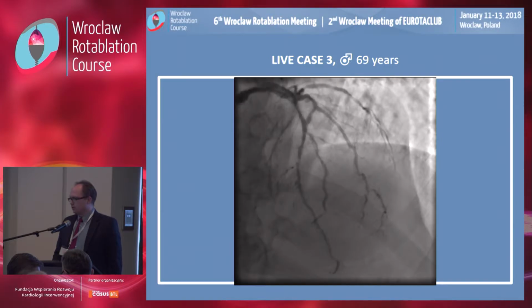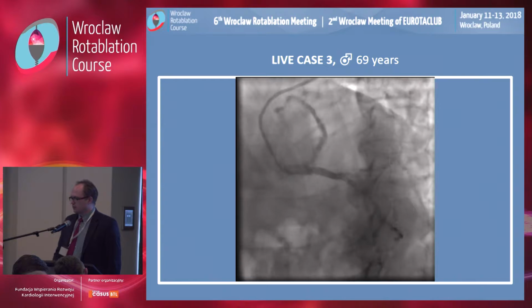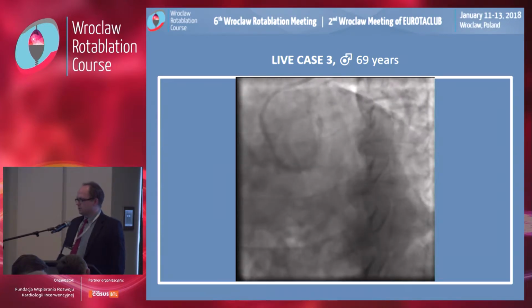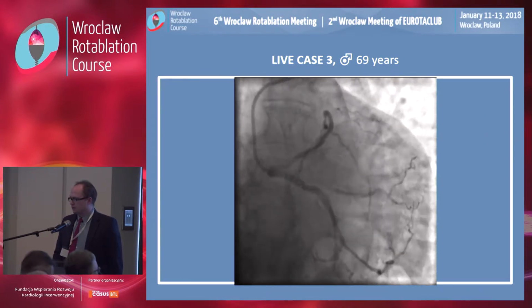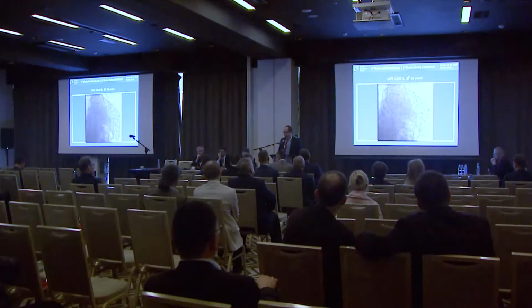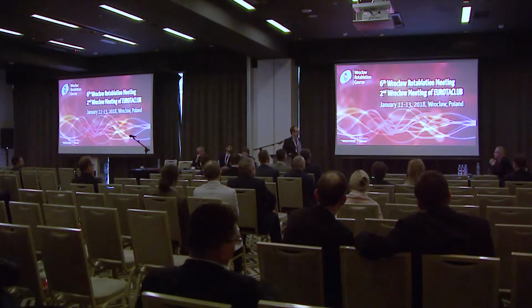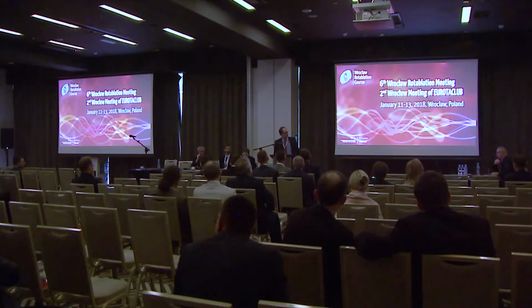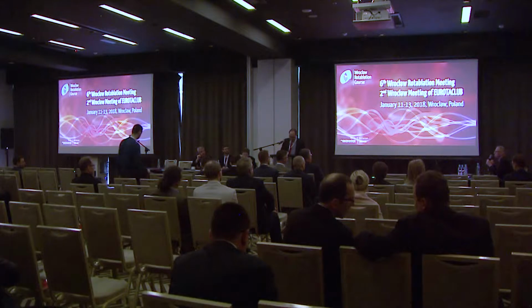After this coronary angiography, the patient was consulted during our heart team meeting and was disqualified from surgery, and now he's awaiting his first procedure. Thank you. What is planned? Do you know what is planned as a procedure? The ostial LAD seems to be the target. LAD 3 times as far as I remember, and I've seen 3 lesions in LAD.